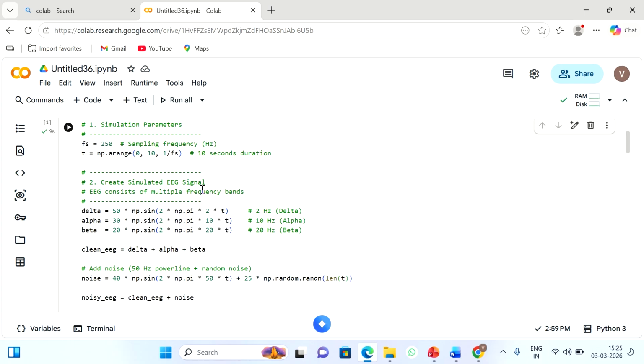But here the scalp, that is the cortex part, we are providing the electrode, and that too it is pasted only, not entirely conducting. The silver and silver chloride, Ag and AgCl, electrodes with the reference electrodes are kept on the scalp, so in between it is acting as an insulator.